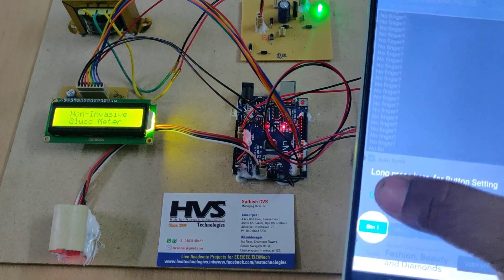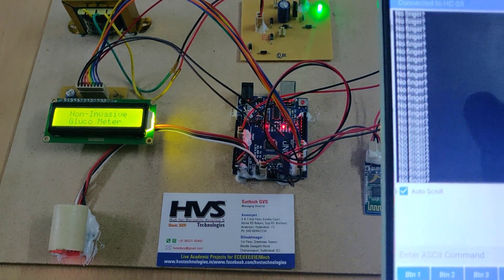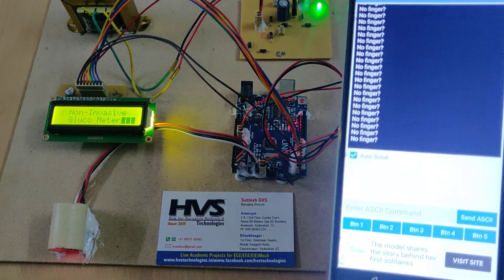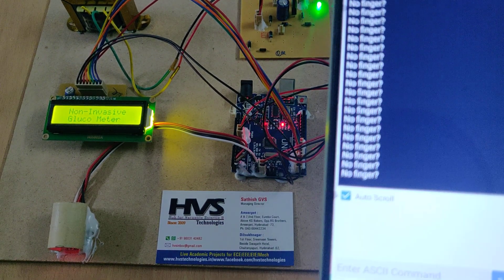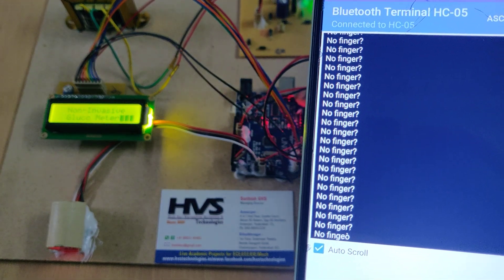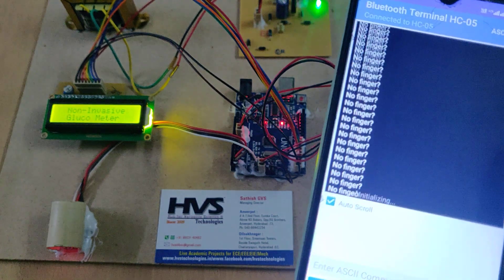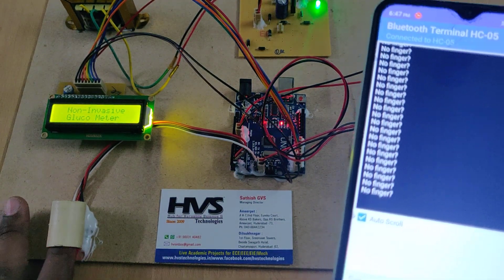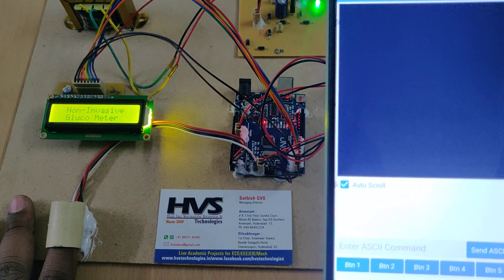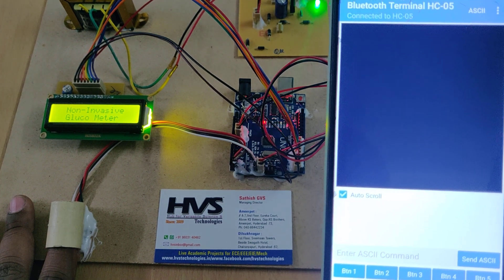As we can see, the Bluetooth module is continuously sending data showing 'no finger detected.' Once we place the finger, it will start calculating the data.